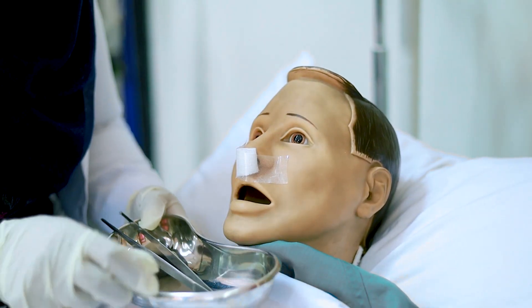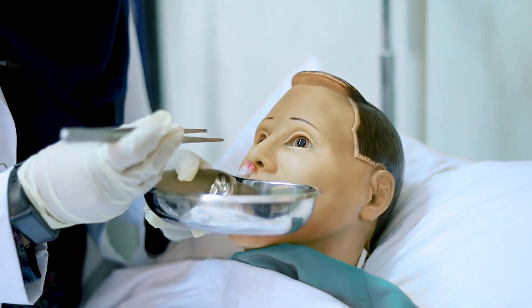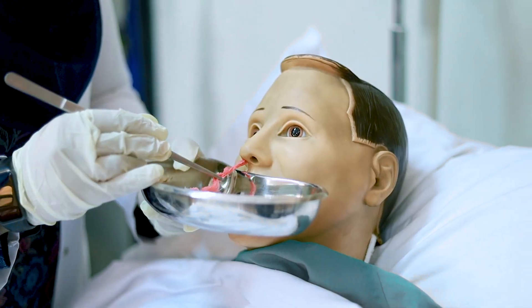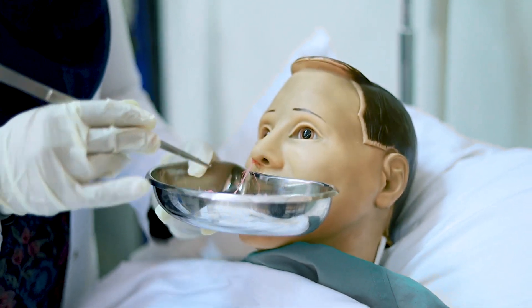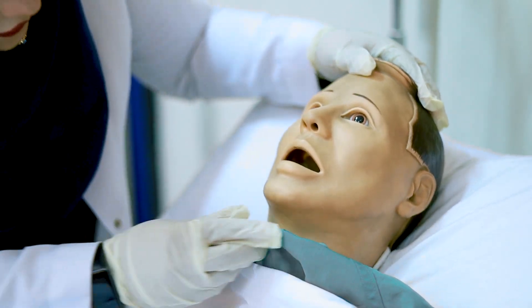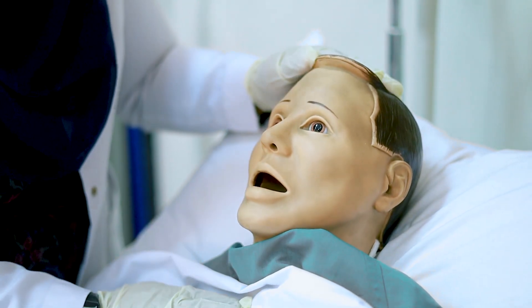Mr. Ali, I am starting to remove your bandage. It will be a little bit painful, so please bear with me. The packing is now totally removed. I have to examine the nose — okay, it's clear. Mr. Ali, how are you feeling now? Okay, good.